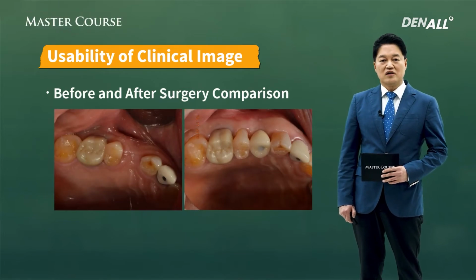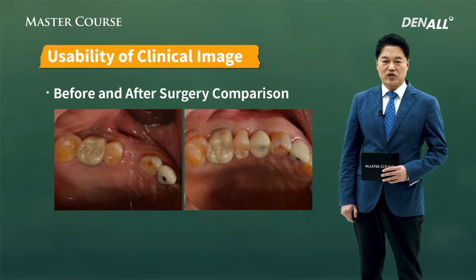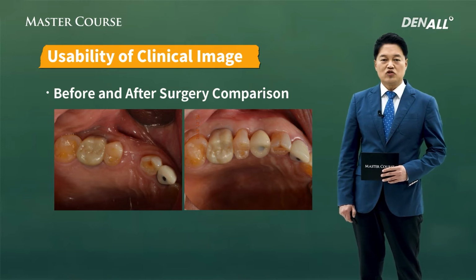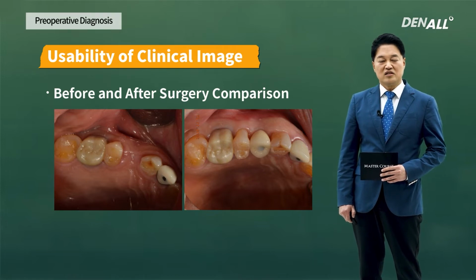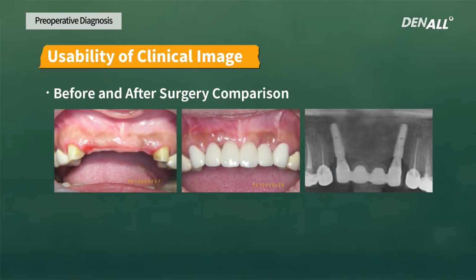As you can see, before and after surgery, images are taken and recorded, and after treatment, you can provide explanation to the patient. It will lead to high satisfaction and you'll be able to gain trust. If you have a similar situation, you'll be able to explain more easily. If there is an implant complication, you'll be able to build a solid foundation for providing explanation. In the anterior area, by comparing before and after image, you'll be able to explain more easily. If something goes wrong, you'll be able to understand better what went wrong.